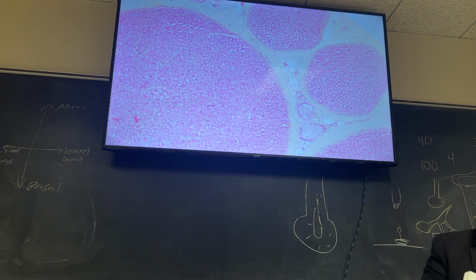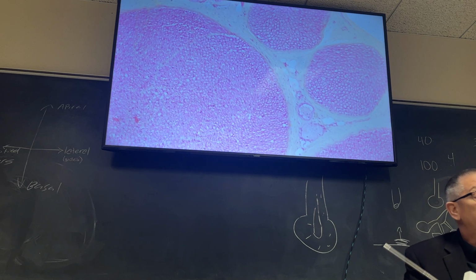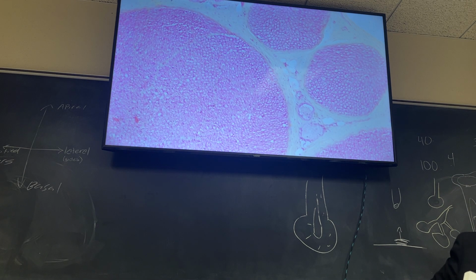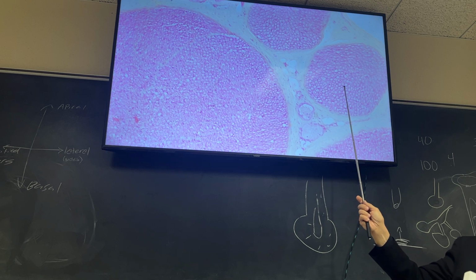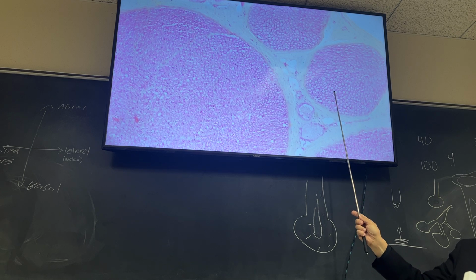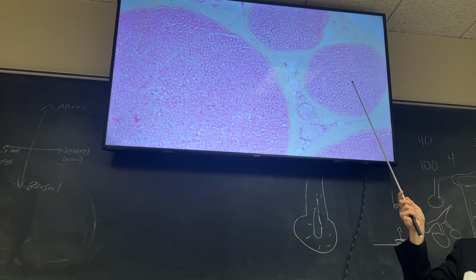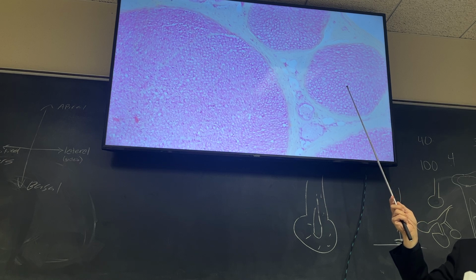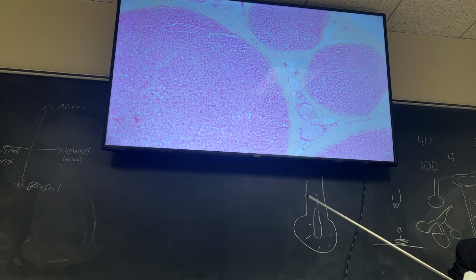Now look at this and just think about what we're looking at here for one second. This is a nerve bundle that's in your body, right? They're not very big, obviously, but just look at this little bundle all by itself. This is just one little piece of a nerve bundle. Each one of those little circles there is a nerve fiber. So how many nerve fibers are in that bundle alone? Hundreds of them, right? And there's how many of those in here? And that's a little one compared to this bigger one. And you have how many of those running through your body?